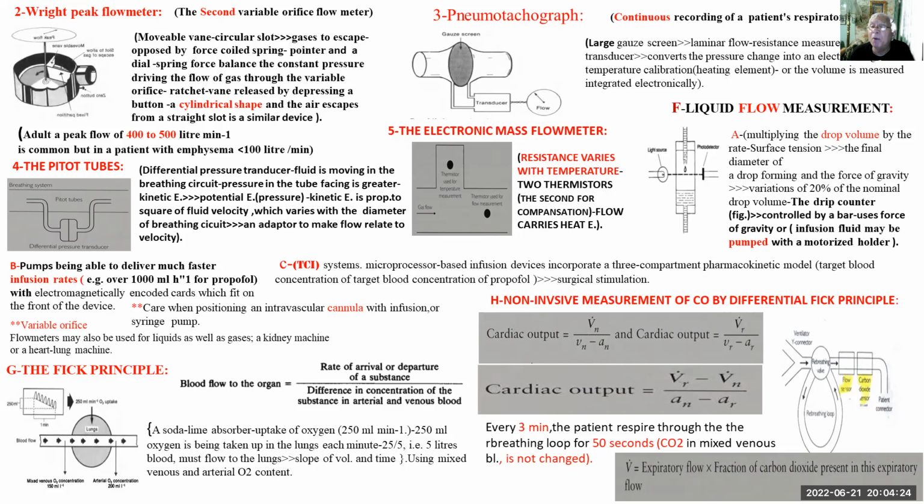The point is, it is not invasive because the arterial or venous carbon dioxide concentration can be evaluated from the end-tidal CO2. So it is non-invasive. I have a screen, and from the screen I can estimate the cardiac output through the end-tidal CO2. Of course, we must keep in mind the shunt equation, which is around 5% of the total. This is the part of blood that does not undergo gas exchange, so we must subtract this amount. It can be measured by the oxygen saturation. If the shunt increases, the oxygen saturation is affected much.